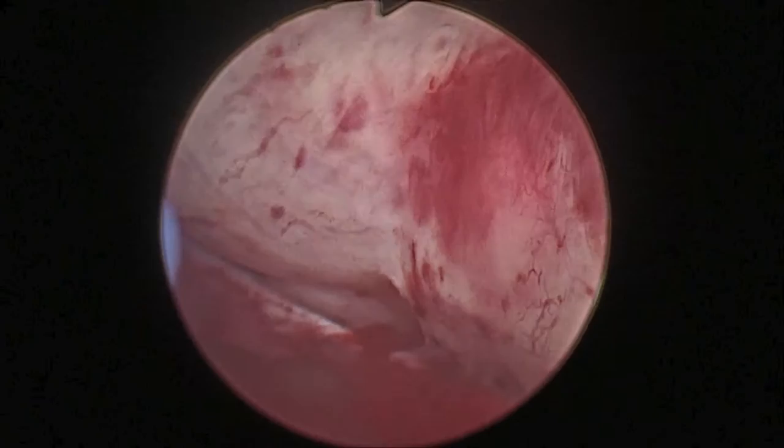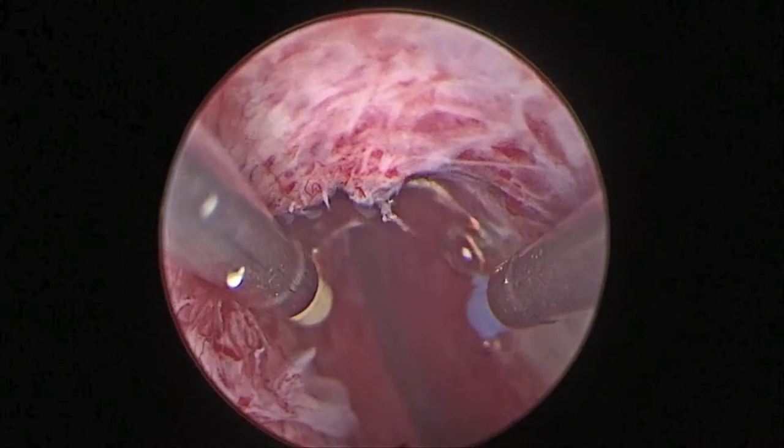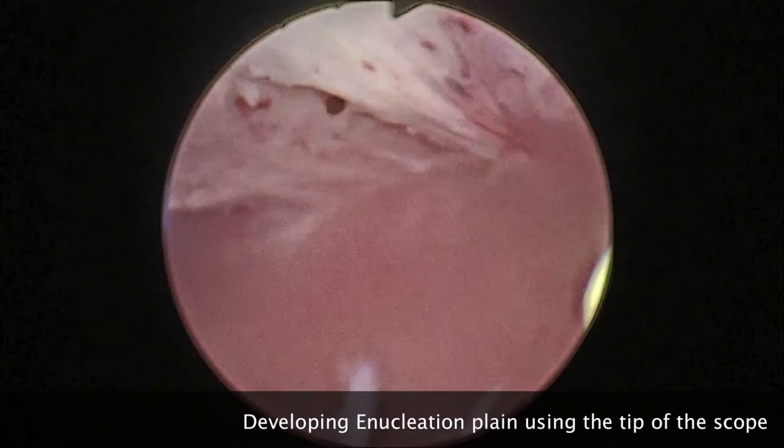For plasma kinetic enucleation and resection of the prostate, the procedure starts by marking the mucosa proximal and lateral to the verumontanum. We use the resectoscope to the apex of the prostate, and we start marking the mucosa at a 12 o'clock position just lateral to the verumontanum. The blunt tip of the resectoscope is used to open up the plane of enucleation between the adenoma and the surgical capsule.